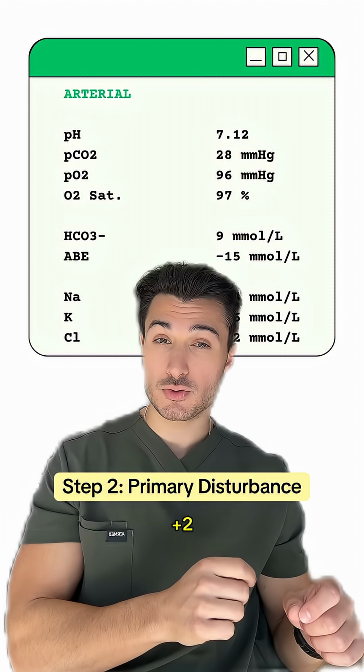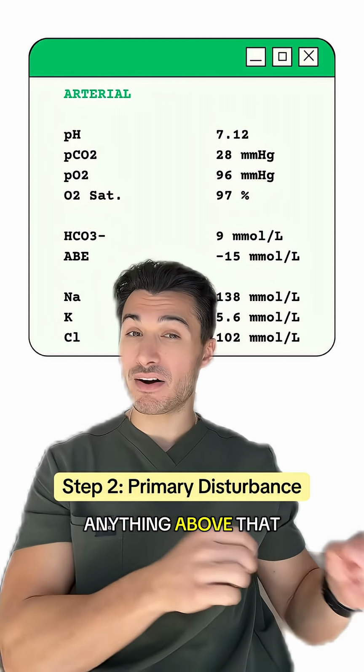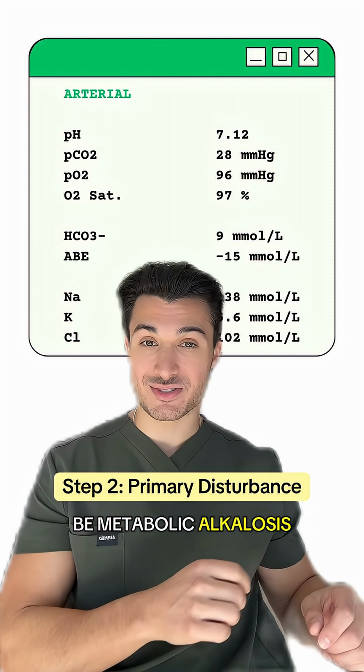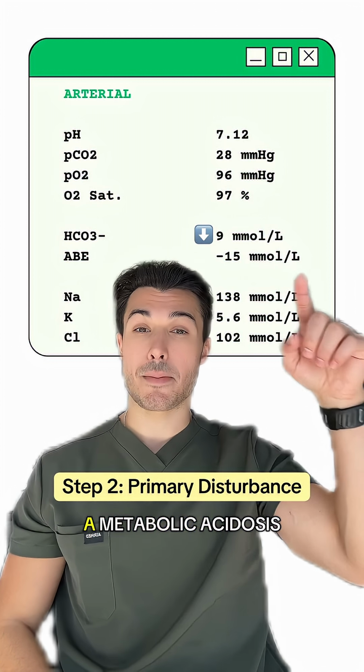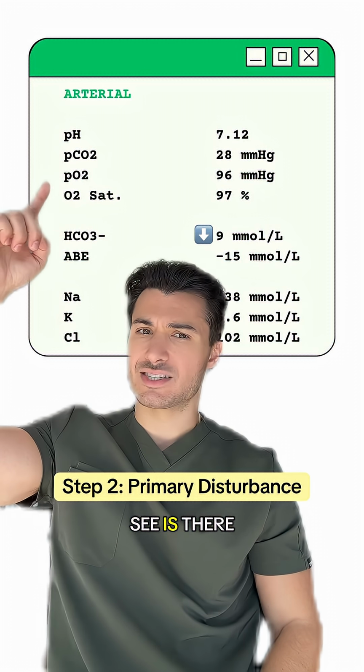-2 and +2 normally. So anything below that is going to be metabolic acidosis. Anything above that is going to be metabolic alkalosis. So here we can clearly see we are in a metabolic acidosis. Now we can look at our PCO2 to see is there any compensation.